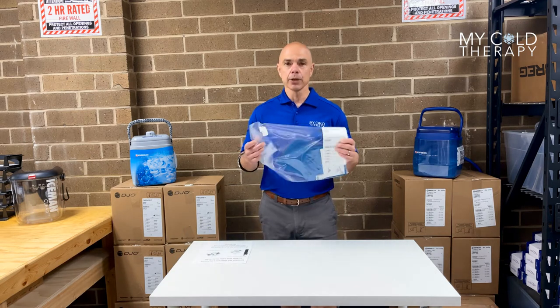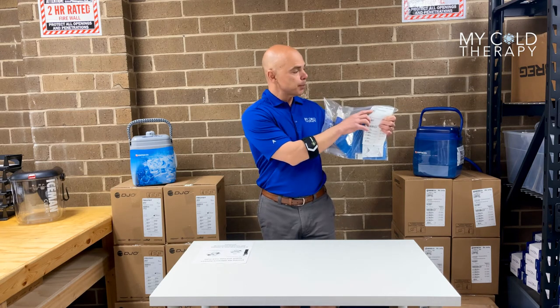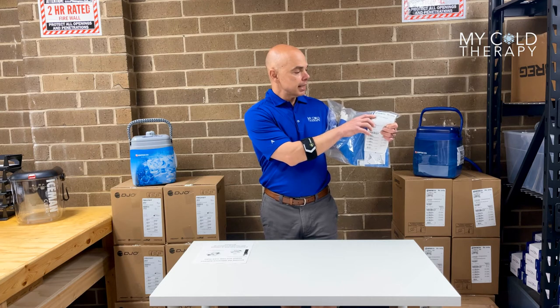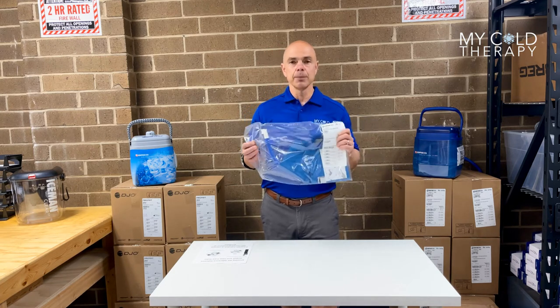This is what it's going to look like when you get it in the mail. Please take note that this is a sealed plastic bag. The first thing you want to do is check the part number on the front — in this case it's 10235 — so that way you know you have the knee pad with compression.